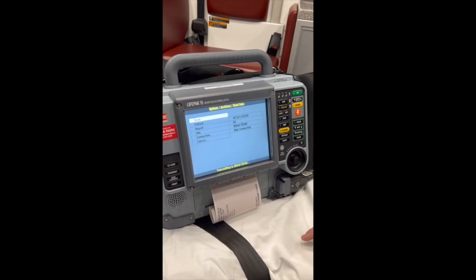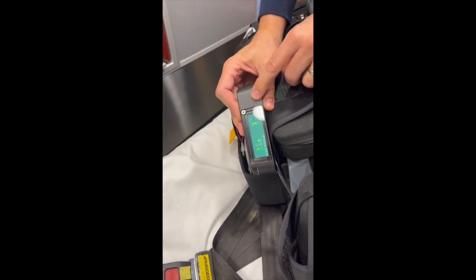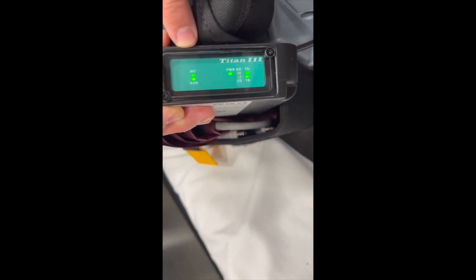While this is sending, I can show you the lighting on the modem. The modem is stored here in the back pocket. You'll see there's flashing lights on here. The big thing you want to be aware of is the WF light is steady. That stands for Wi-Fi. And the run light is flashing. That means it's connecting and running appropriately.